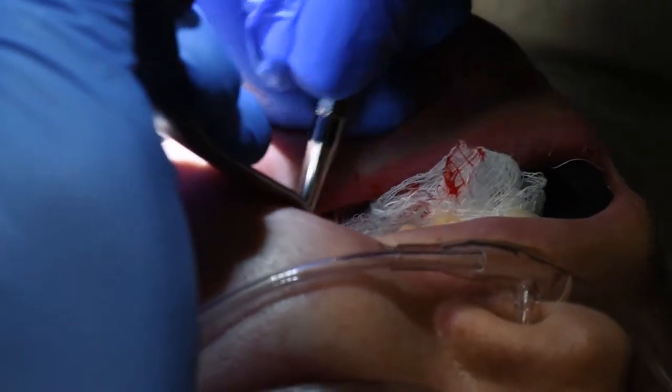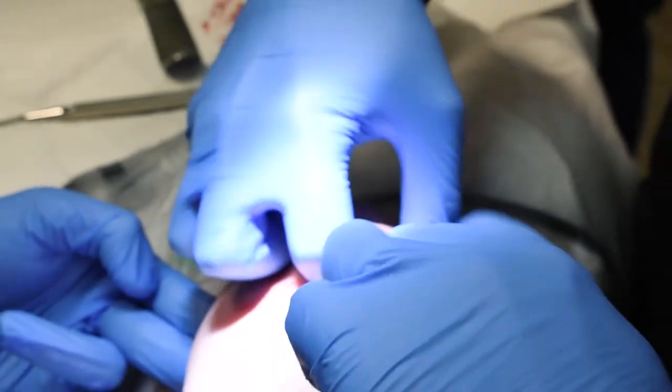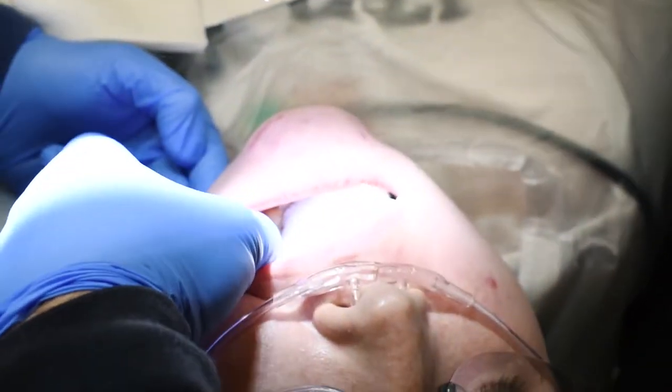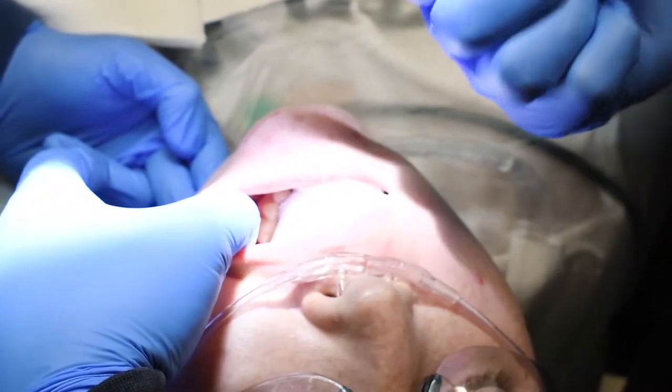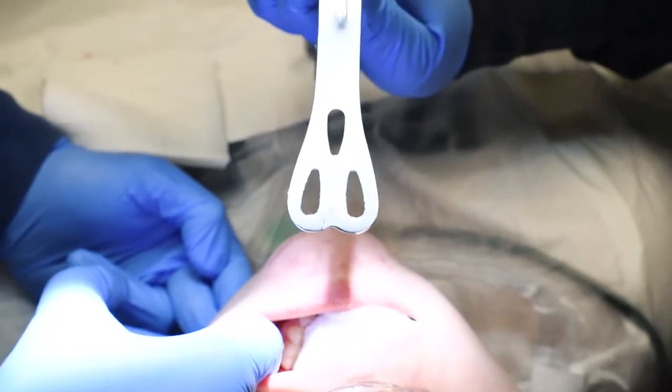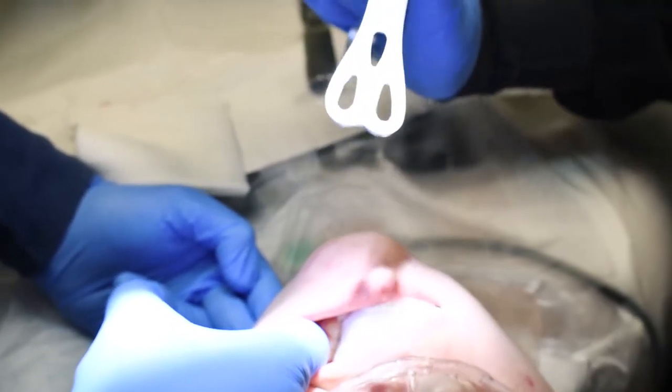Justin likes to pull the gauze in front to make things a little more challenging. I'll switch out the gauze since it's saturated, and put my bite block farther back in. The gauze likes to kind of be a part of this with the tongue flicking it over. This instrument is called a Weider tongue retractor, also known as a 'sweetheart' — Justin used to think I was calling him sweetheart, but no, it was just the retractor.